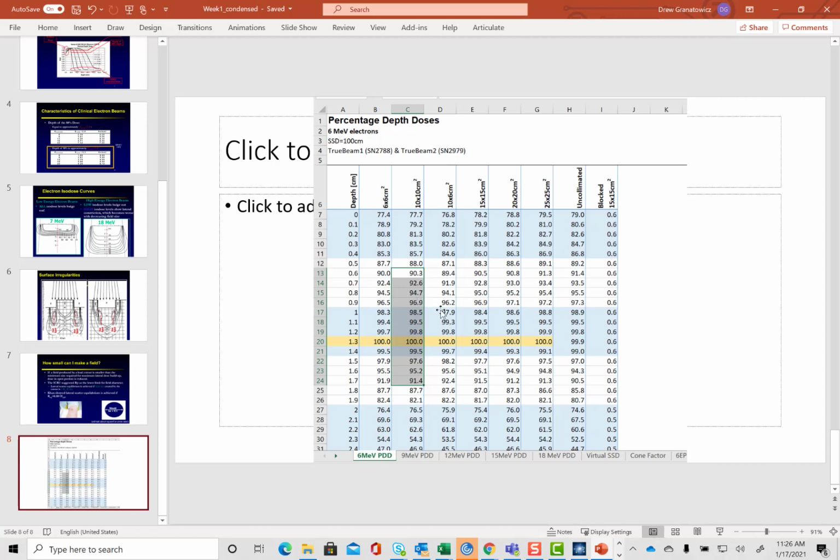which we'll go over, what this looks like in a treatment plan, shortly. But another important thing to realize is that this is assuming perfect conditions, right? Perfect 100 cm SSD throughout your field, flat field, or flat patient, perfectly homogeneous water. So you're never really comparing apples to apples when you look at this data book and then try to translate this to a real patient. But it's all we had for a long time. So a lot of the clinical data that doctors are going off of, actual results, are based on looking at data tables like this. So it's still relevant because of that.